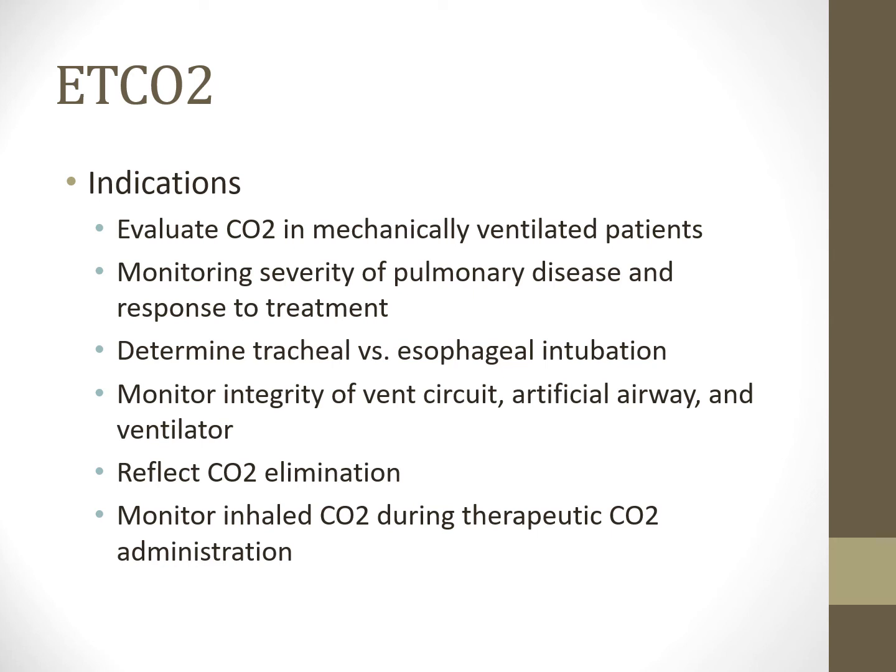Reflect CO2 elimination. We can see if their metabolic rate is increasing or decreasing. We can see so much with how much their metabolic processes are going on. We could even do indirect calorimetry, where we can actually see what their metabolic rate is and if we're giving them enough nutrition for their metabolic rate or if we're overfeeding them and causing too much CO2 production. So there's a lot of value to this, especially with thermal injuries or burns. We might do indirect calorimetry on them because if they don't have those skin layers or tissues, they can easily lose a lot of energy or they can get cold or hot and it can change a lot of things.